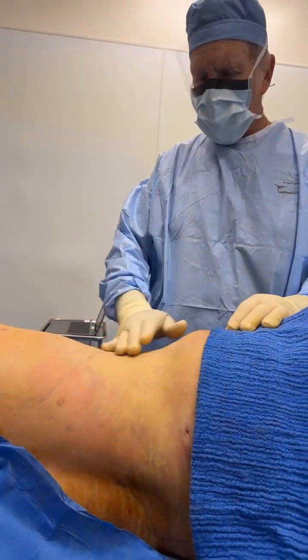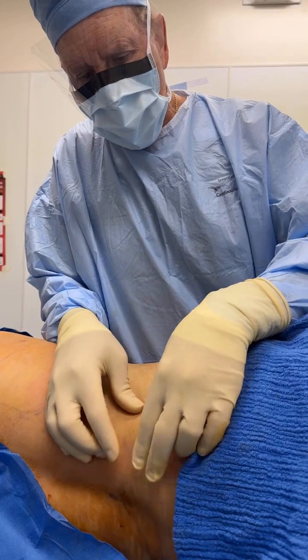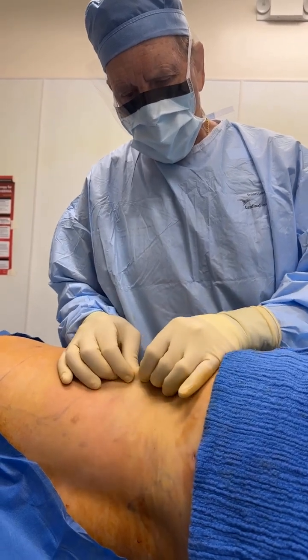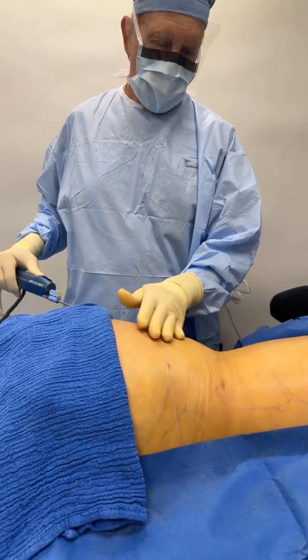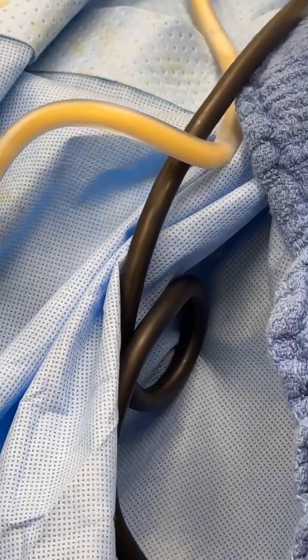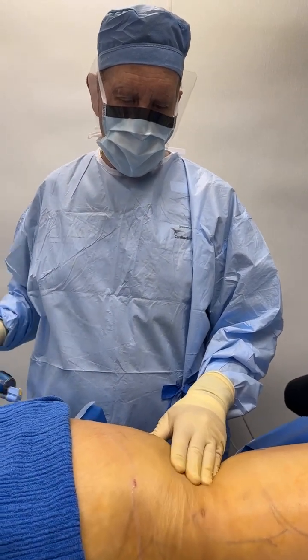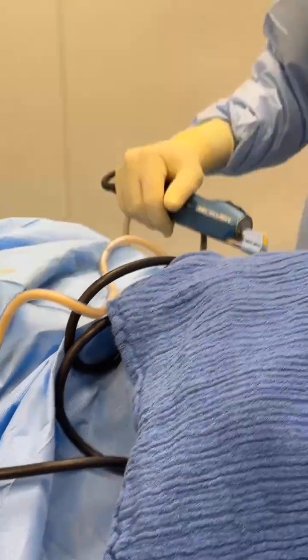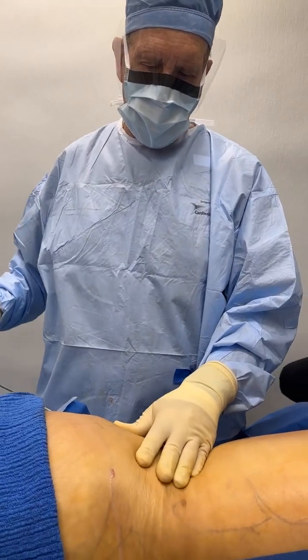This is the pinch test — she's on her side. You can see the waist we gave her. We pinch here — see, that's the pinch test — down to nothing. The patient is in lateral decubitus. We're just getting started on the other side, but look at that fat. You may think it's going to take a long time going so slowly, but our cannulas are extremely efficient, especially because we don't have to process the fat. That yellow fat you see there is what's going into the booty.